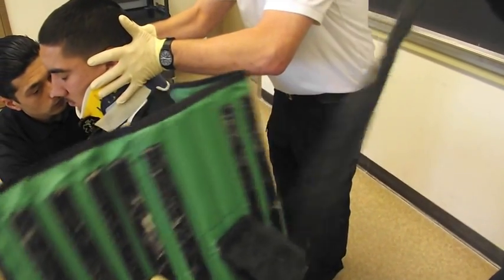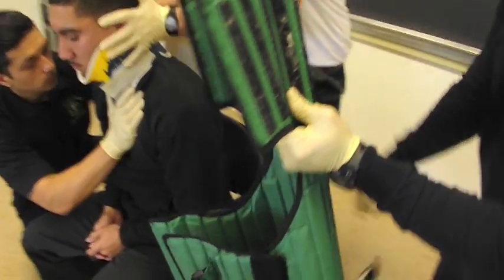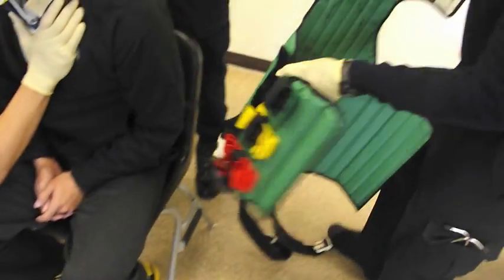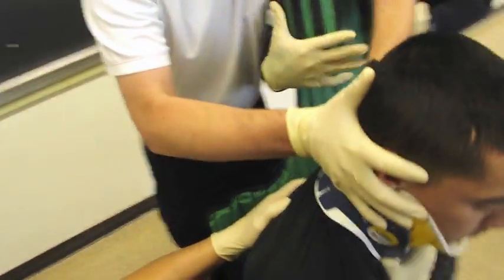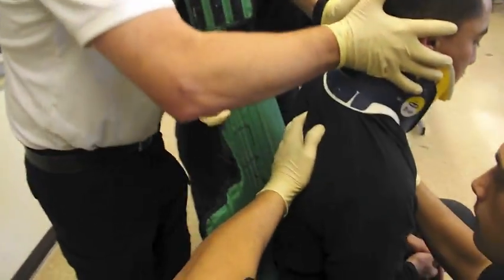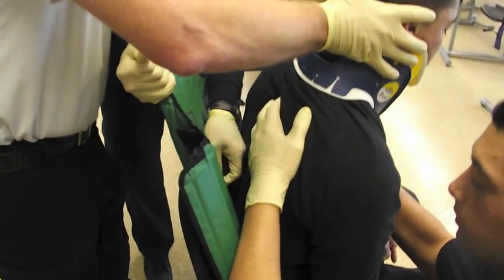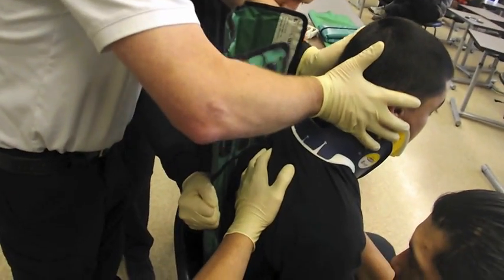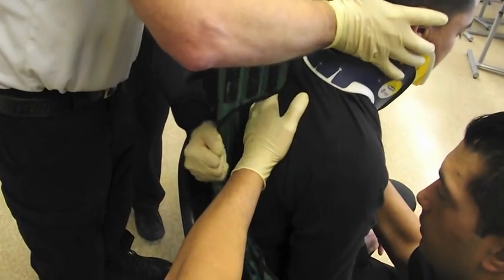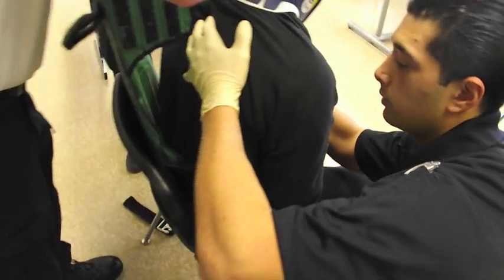Pulling the hip straps off first before you place the KED on can save you a lot of trouble and get them out of the way. Oftentimes in placing the KED, especially on someone wearing a belt, the KED will get stuck on the belt, causing you to think that it's actually at the bottom of the seat or the base of where the patient is, which is where it needs to be. So carefully, without moving the patient too much, they're going to do their best to shimmy it down to the bottom.